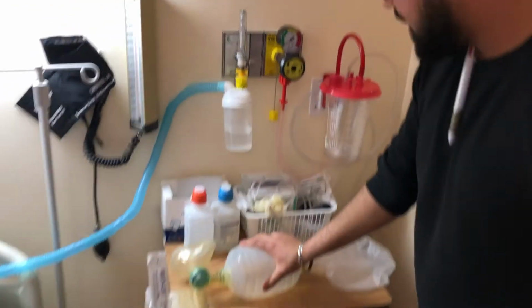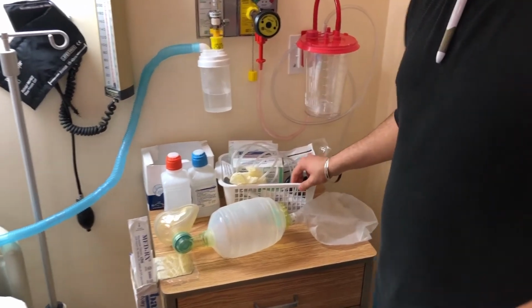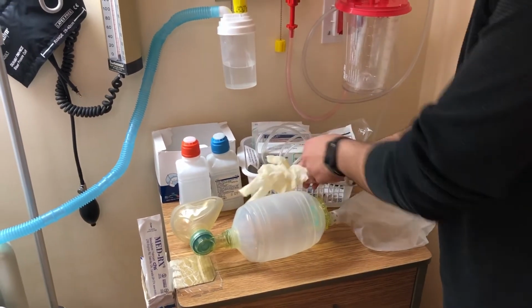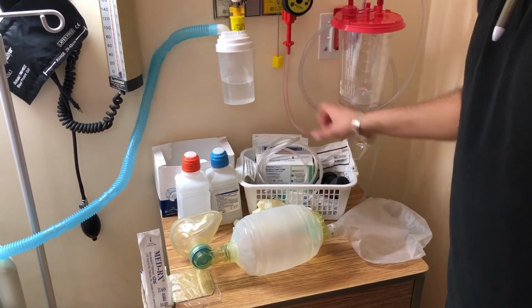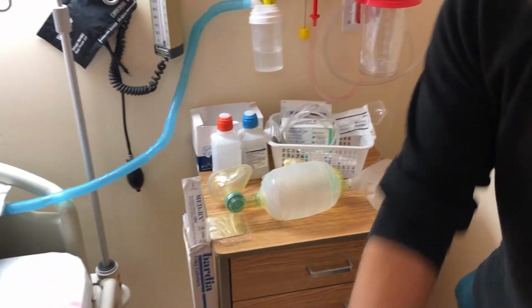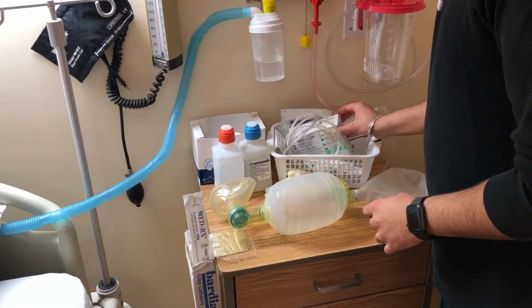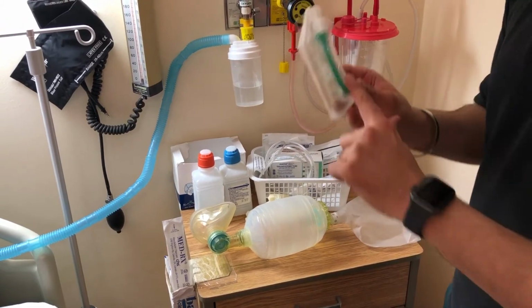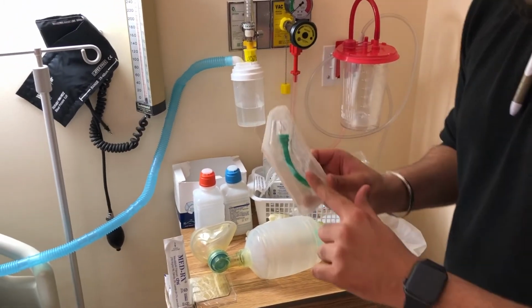We also have the ambu bag here. We have our safety equipment just in case an emergency arises. So in this we have our ambu bag tubing. We have our measuring cuff, which I'll need in a second. And then we also have extra trach tubing. We have our extra DIC.